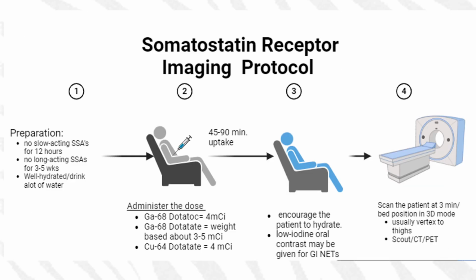This is the protocol at a glance for somatostatin imaging. The preparation: no slow-acting somatostatin analogs for 12 hours, no long-lasting ones for 3 to 5 weeks. Patient can eat and drink whatever they want, but they should be well hydrated.